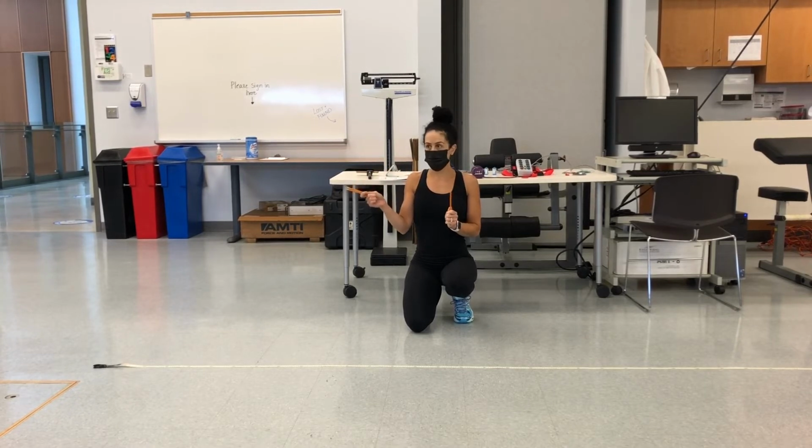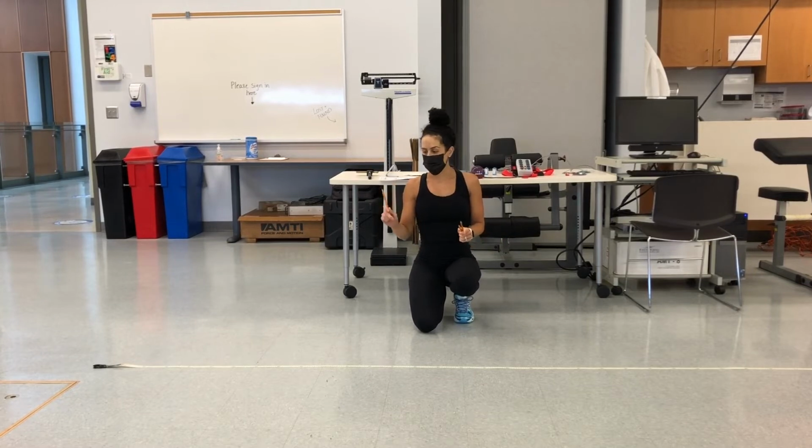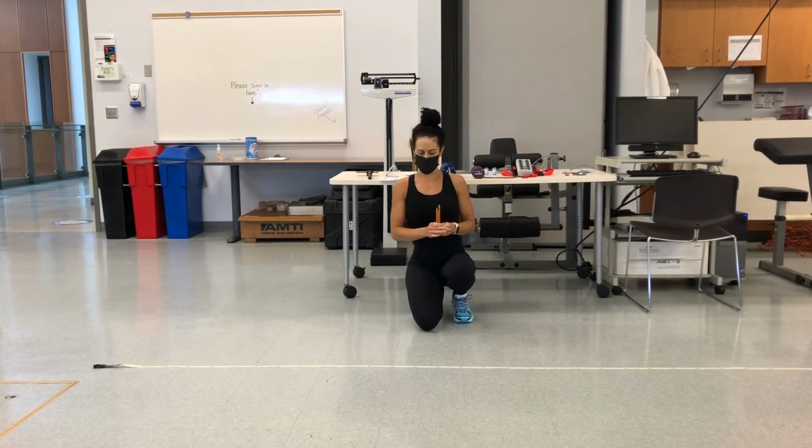Hand over the stopwatches to whoever happens to be your participant, because that's going to be easiest. If you have someone else, they can use the stopwatches. And then you're just going to have the participant walk by. You're going to do your very best to record where her steps are, and then you could look at step length and stride length, keeping in mind that 1 stride is a gait cycle or 2 steps is a gait cycle. So whenever you're ready.